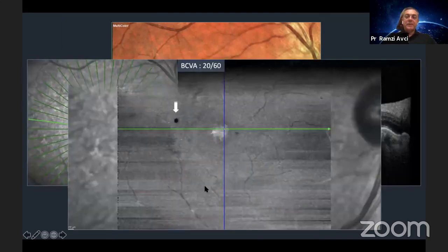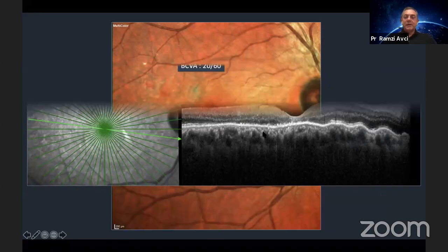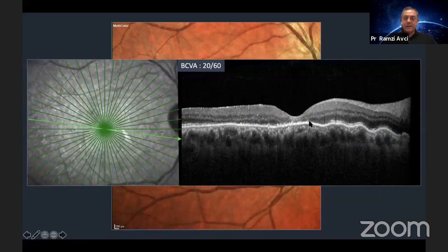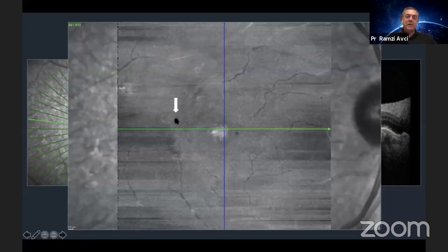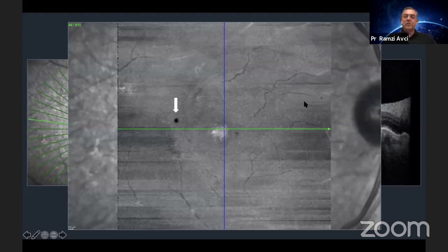And this is after surgery. You can see the pictures, and this is OCT. Perfectly, you see the bubble is already gone, but on fast OCT, yes, the fovea is okay, but on the temporal part of the area, there's still a small piece of PFCL bubble. So this is the end of this case. In this technique, in this patient, I prefer to aspirate the PFCL bubble after the BSS injection and detaching the retina of the macular area.